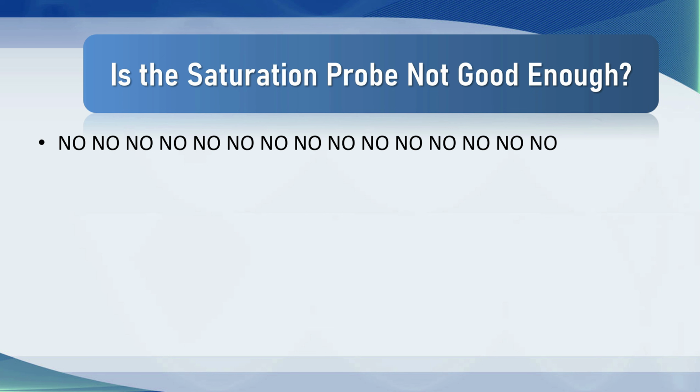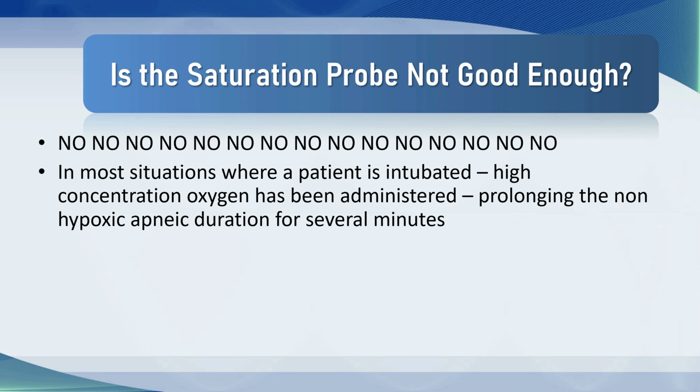No, it's not good enough. In most situations where a patient is intubated, high concentrations of oxygen have been administered. If you fill the lungs with oxygen, remember the lungs are normally nearly 80% filled with nitrogen, this prolongs the non-hypoxic apnea duration for several minutes.